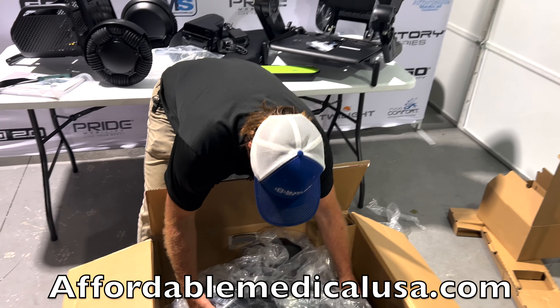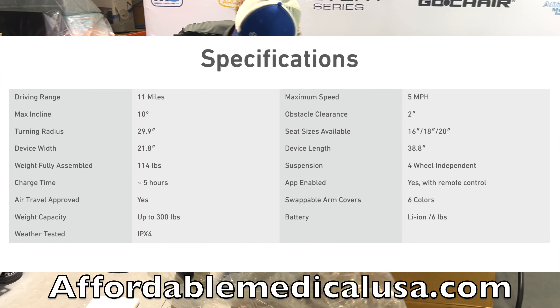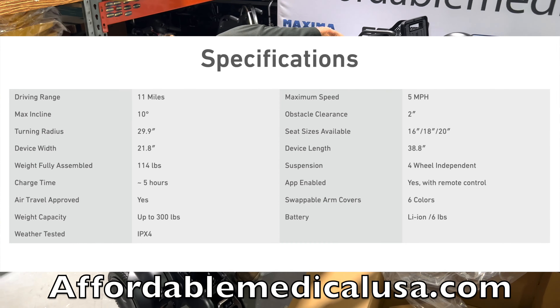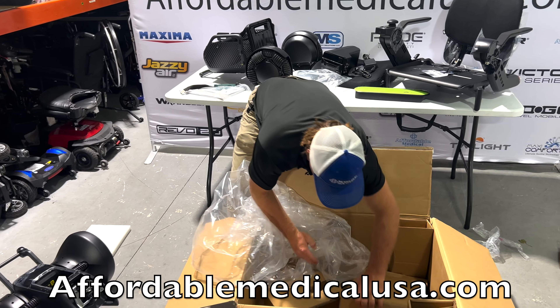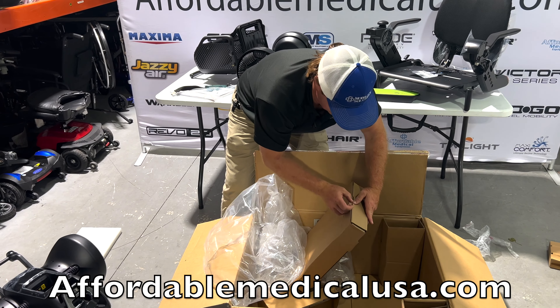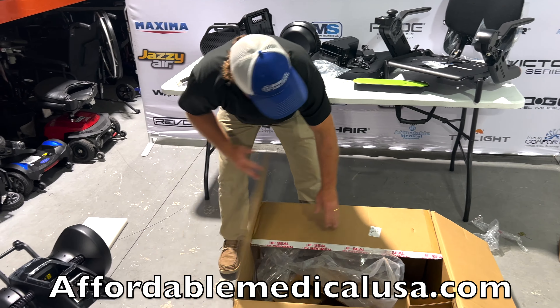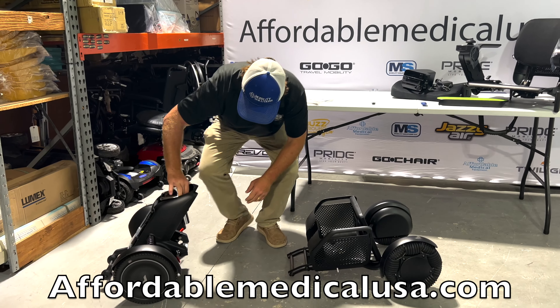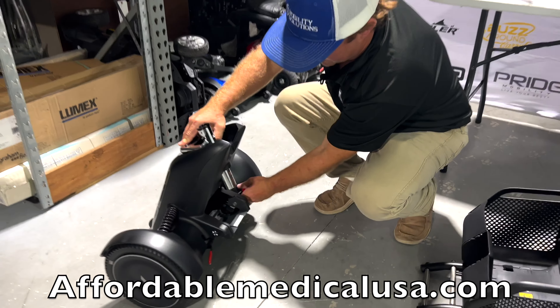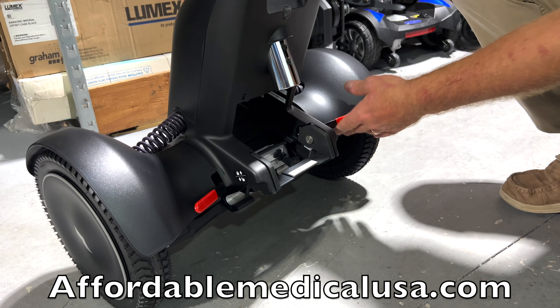Here's the back of the chair — this would be your heaviest part. I'll get you specs and weights in just a moment. Go through and double-check to make sure there's nothing else in these boxes. Basically you've got three or four parts. We include the battery. This is the back end — it's about 42 pounds. This part is 38 pounds. It's got a little handle. This is your release to put it in free-wheel mode so you can push the unit if the power is out.